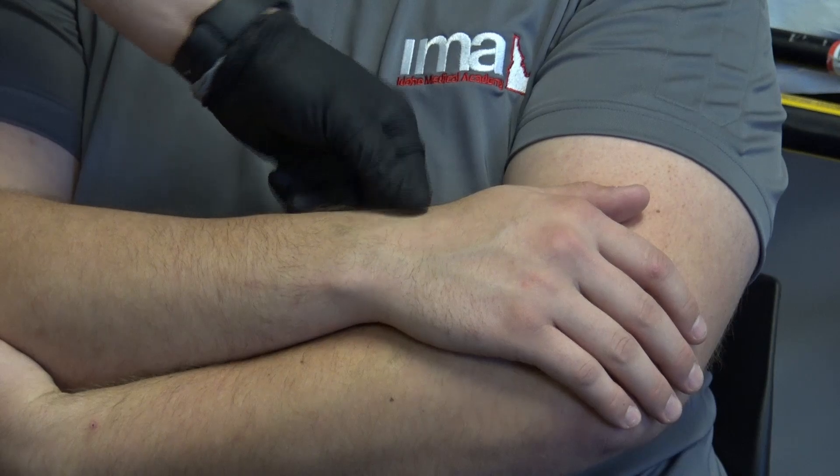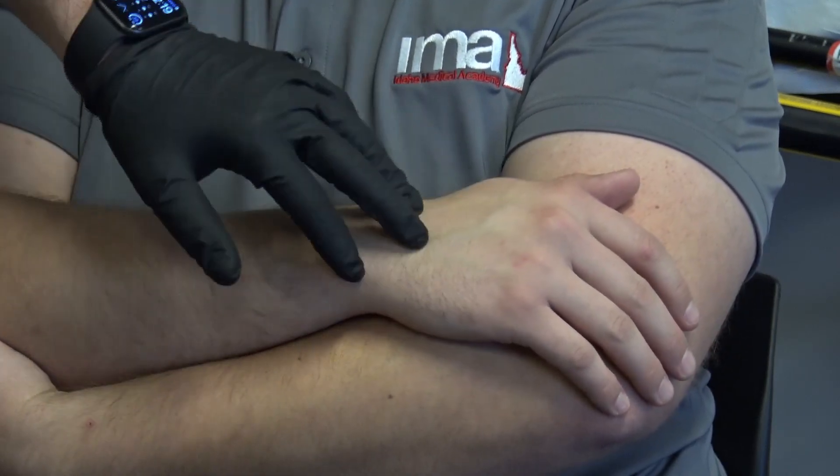Just like every other skill sheet, the first thing we have to do is BSI — making sure our scene is safe, so I've got my gloves on. Scene safe, I'm going to come up to my patient and make sure they're manually stabilizing their extremity. Most patients in pain will already be self-splinting, especially with an arm injury — they're holding it in place. Next we're going to check CMS: circulation — check a pulse; motor — can you wiggle your fingers; sensory — can you feel me touching. CMS is intact.